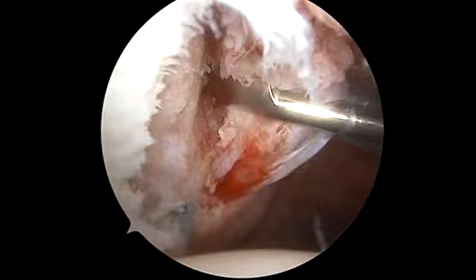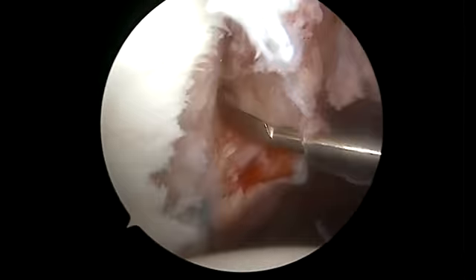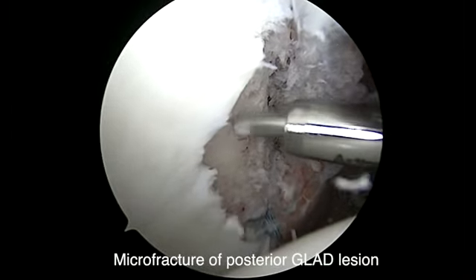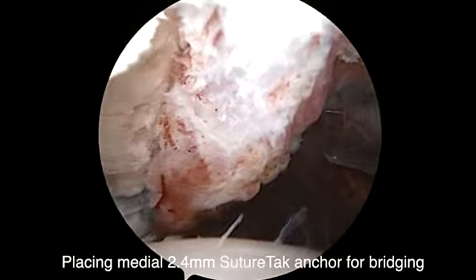The posterior capsulolabral tissue and bony fragment are elevated from the posterior aspect of the glenoid to allow for adequate mobilization for repair. A microfracture of the subchondral bone within the cartilaginous defect on the glenoid surface is performed with a power pick to promote fibrocartilaginous healing.